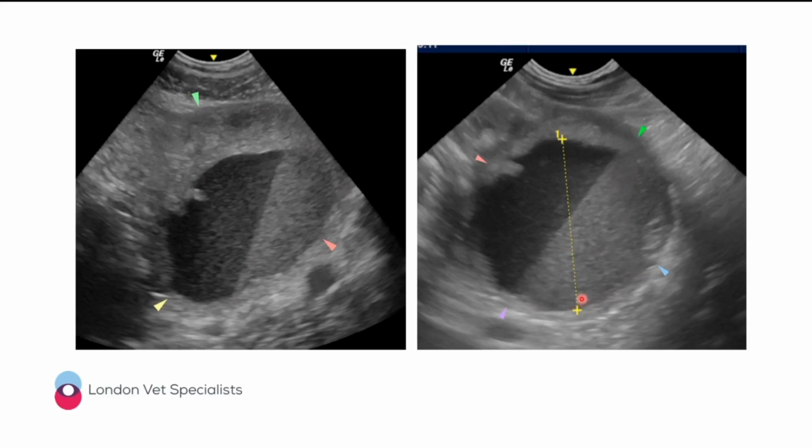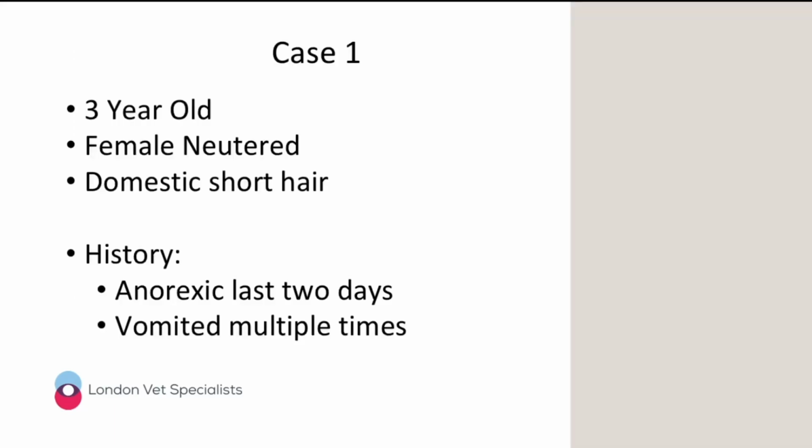this very echogenic fluid. So we've got all of the most dense cellular debris that's within this abscess settling in the most dependent part, and then all of the least dense fluid accumulating in the non-dependent part. So we completely drained this abscess, and I think the patient, if I remember rightly, was treated medically and did very well.